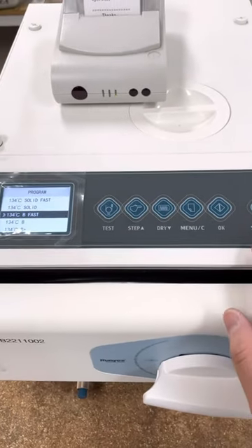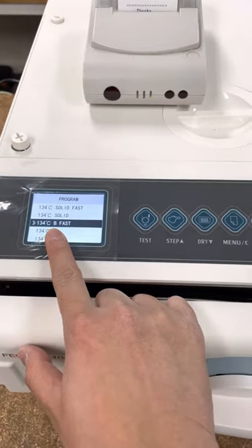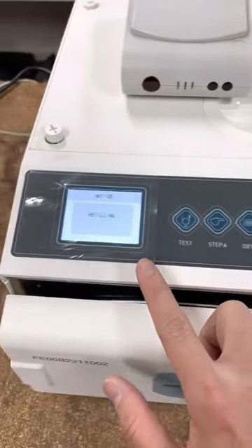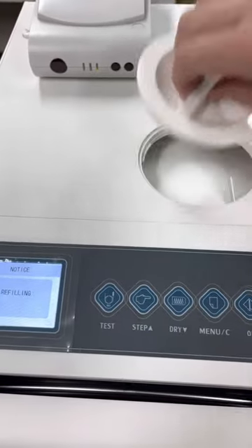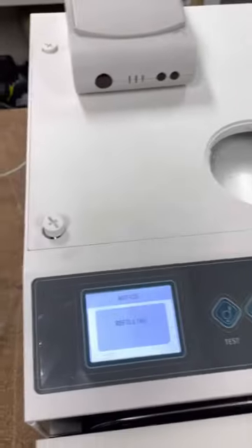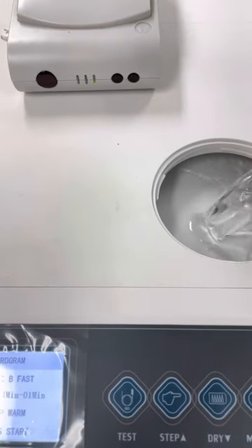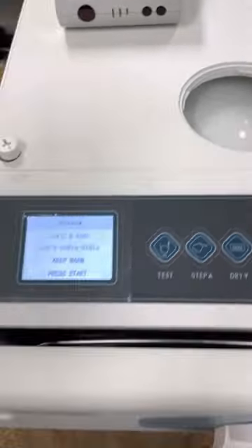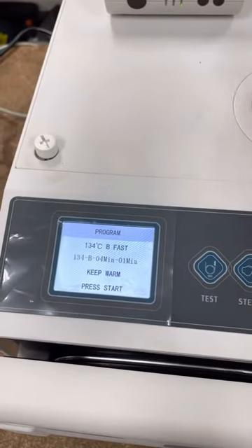I'll show you how to run the cycle now. Say we are running the 134 degrees B fast — click on OK. It will be asking you to fill in water because I haven't done so. Put some water in, and once there's enough water it will tell you that you can click on start to begin.